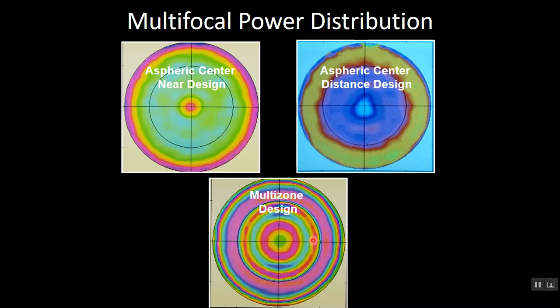The attempt being in all these lenses to provide simultaneous vision, meaning all the focal distances are provided to the patient, and we are hoping that the patient will be able to pick up the power or vision they need for their visual function.